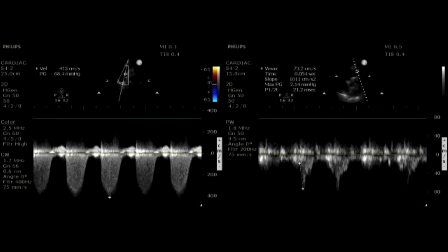So I guess we'll wrap this section up, but I wanted to talk a little about one thing. Ashish, you mentioned a little bit about this pulmonary notching, and I did want to hit on that if we had time. So we see a little bit of that here on the right side of the image, but one of the other things that can be seen in patients with PE is this notching of the pulmonary artery Doppler packet. So can you tell us a little bit about this pulmonary notching, what's causing it and what are we looking for here?